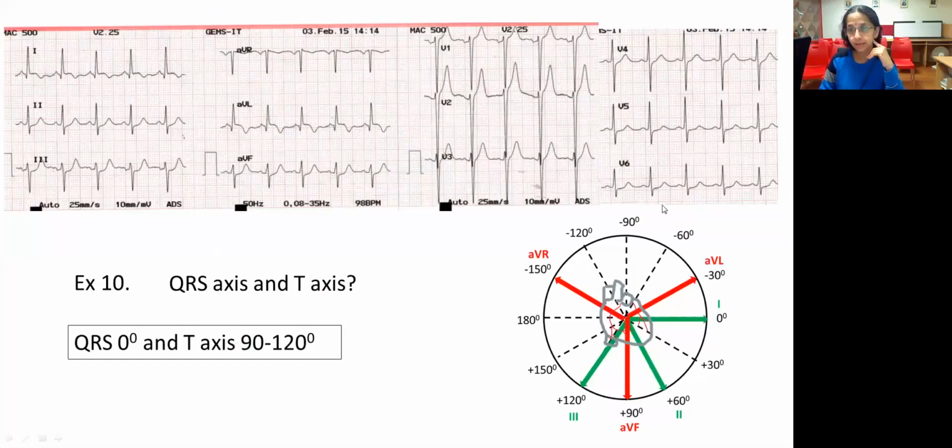So you can see here, in addition to that, your horizontal plane, and you can see where is your T wave axis and QRS axis here. So you can see clearly that your QRS is negative and T is positive. So both of which are going to come in different quadrants. So if you see your lead V2, your QRS is dominantly negative. That means your forces are more posterior, and T wave is dominantly positive, so it's more anterior. So you can see here also in the horizontal plane, your QRST angle is wide and your T wave axis is abnormal.